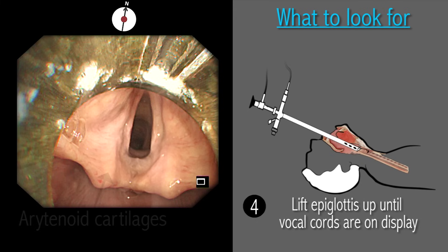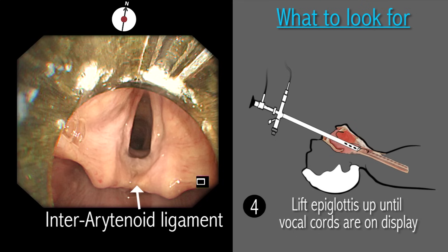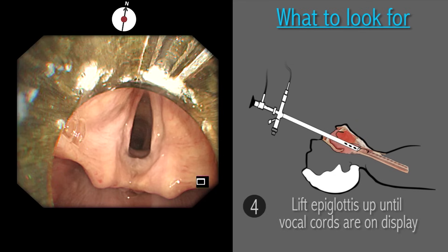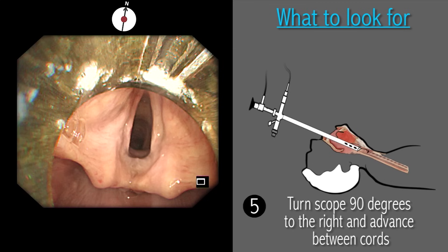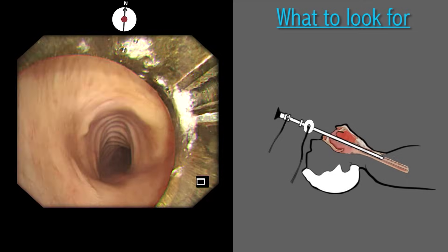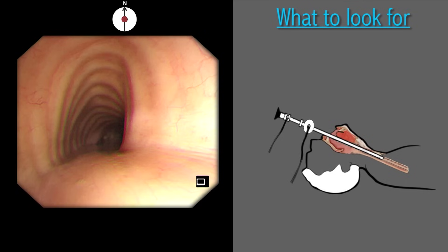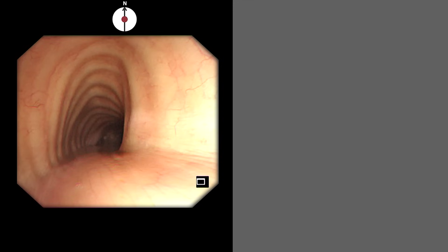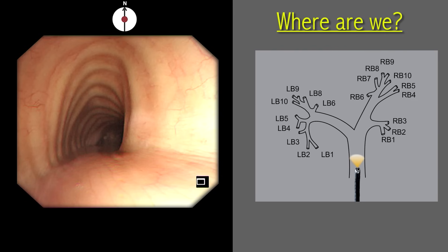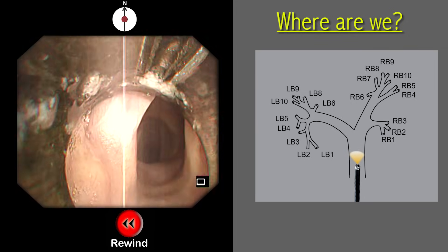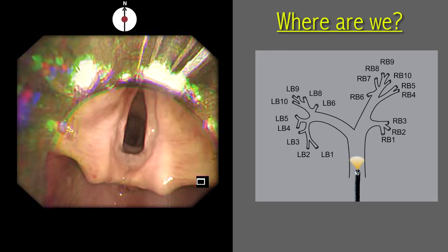Here are some anatomical landmarks to help you describe anomalies to your ENT colleagues. With good muscle relaxation, the cords are seen to be abducted away from the median line and stationary. The rigid scope is then turned 90 degrees to the right before introducing it via the cords. This maneuver aligns the shortest diameter of the tip of the scope transversely to avoid damage to the cords. Once in the trachea, the Venturi device is connected to the rigid scope to establish ventilation, and the operator can now relax and introduce the flexible scope through the rigid one to examine the central airways.